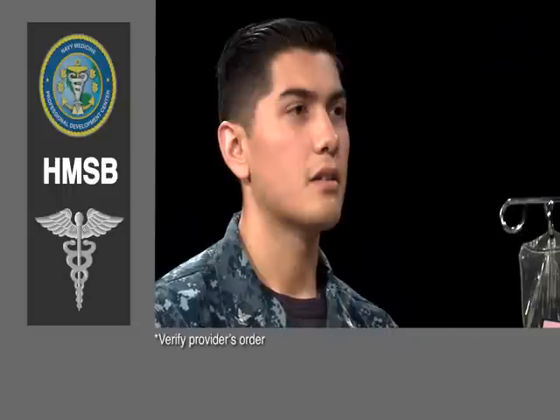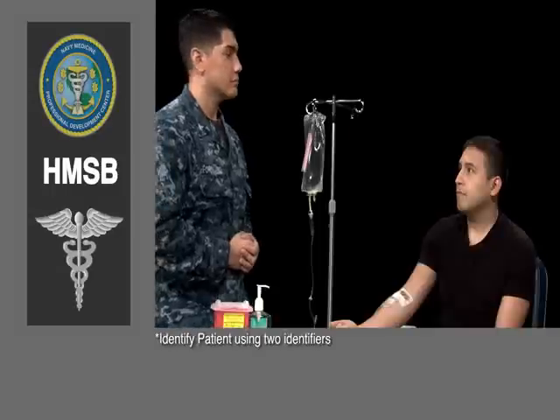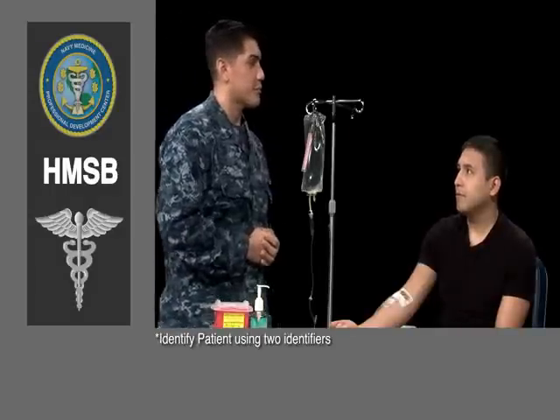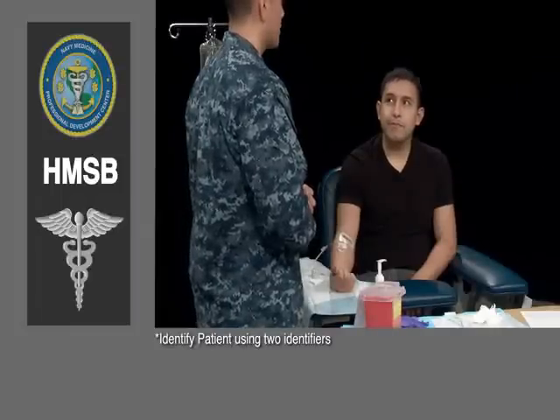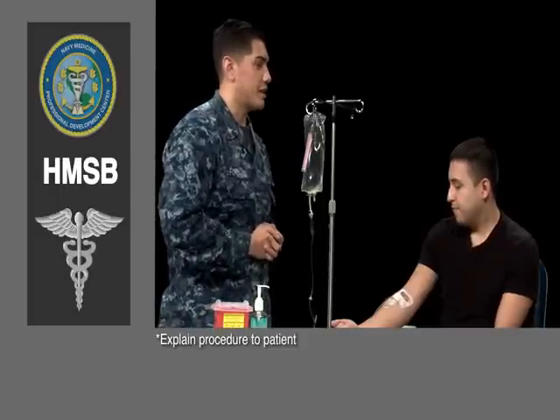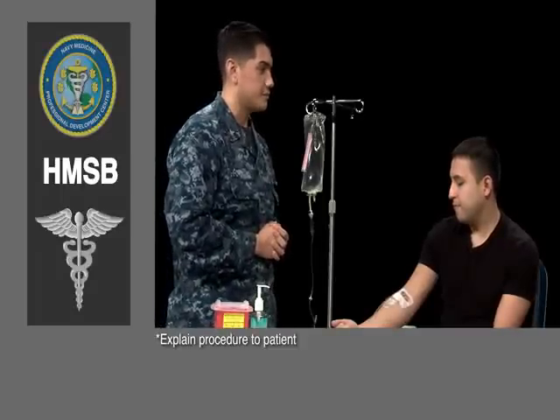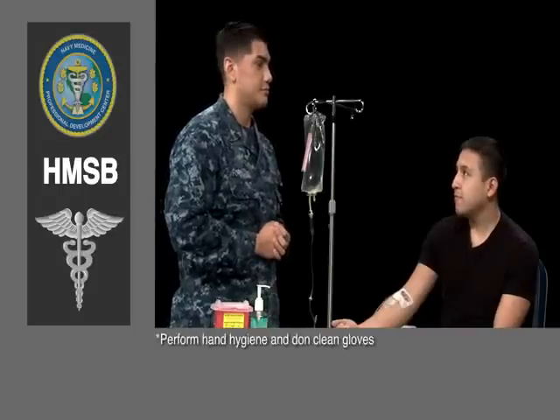The provider has now ordered that you discontinue the IV. First, I'll verify the provider's orders. Then, I'll gather my equipment. Hello, sir. I'm HM3 from Mono, and I'll be assisting you. Can you please confirm your full name and date of birth? Okay, so your provider has ordered that we remove your IV. Do you have any questions before we begin? No, I don't have any questions.